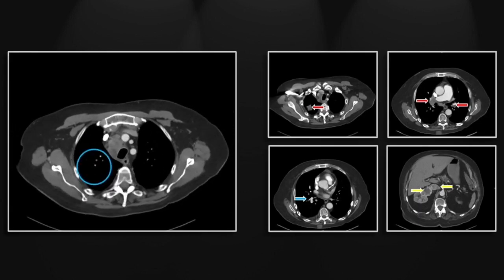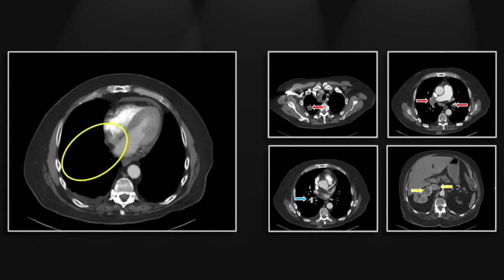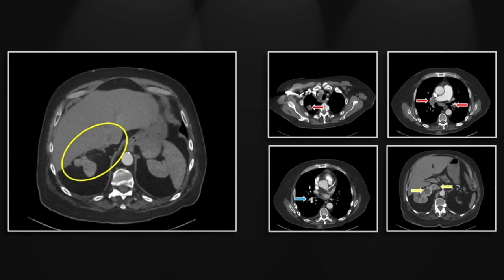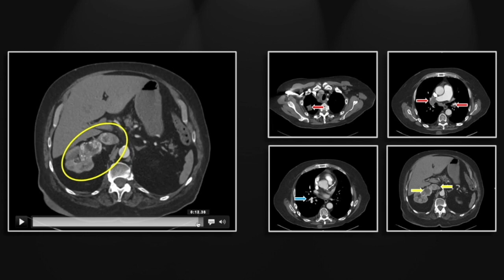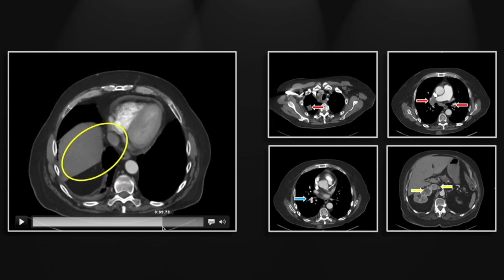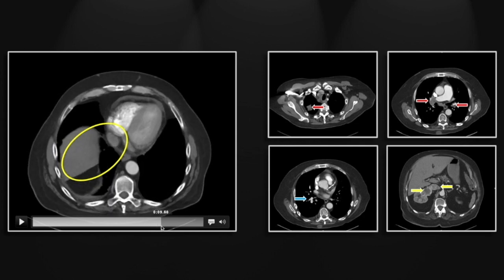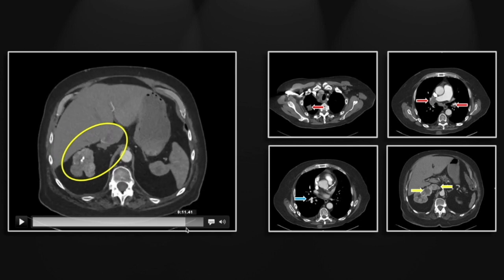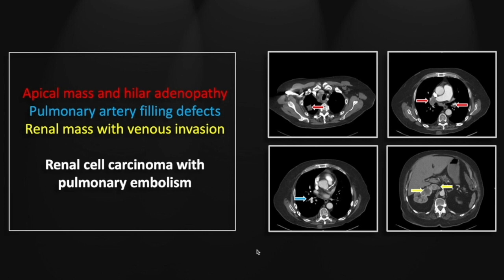There is that hypodense mass and the filling defect, and the renal cell carcinoma extending through the renal vein and well into the IVC. Its hypodense filling defect extends all the way up almost to the right atrium, certainly to the level of the diaphragm. So that is a case of renal cell carcinoma with acute presentation with pulmonary embolism.